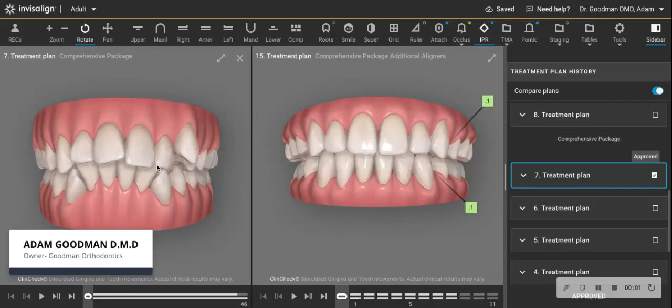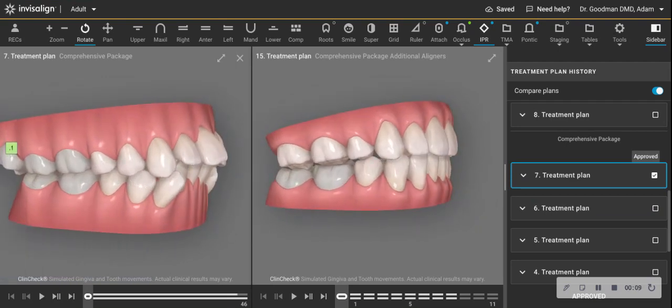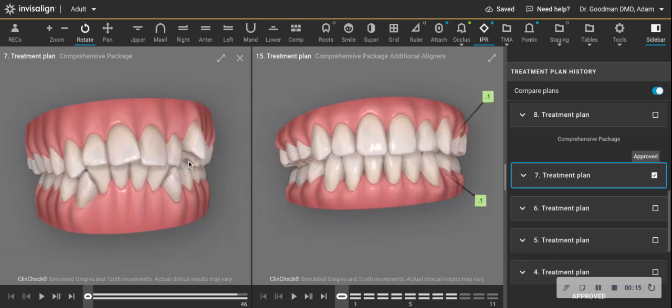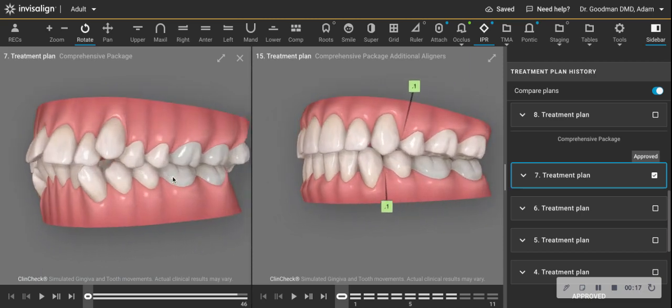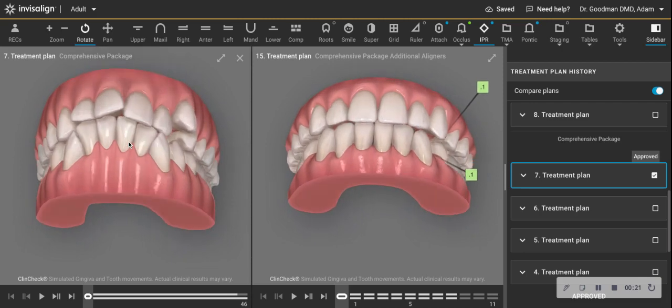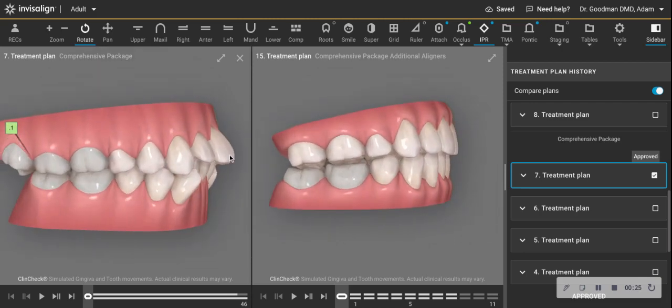Hey, this is a treatment that is near completion, and I just wanted to review it with you. It is a four bicuspid extraction case treated just with aligners. Now, I love non-extraction treatments, but most orthodontists will recognize in the starting positions on the left here that we have extreme crowding, but also some bimax protrusion.